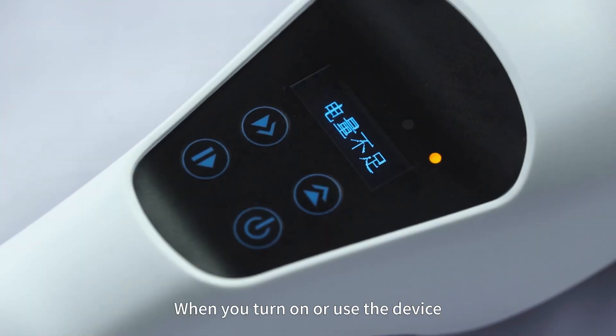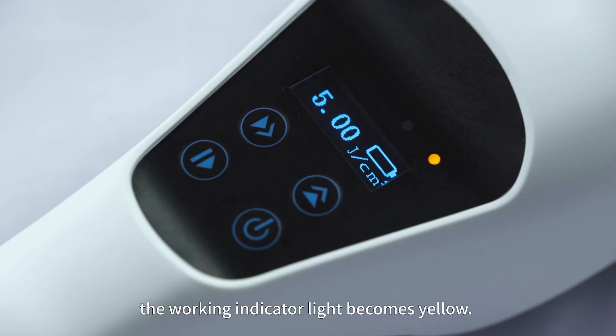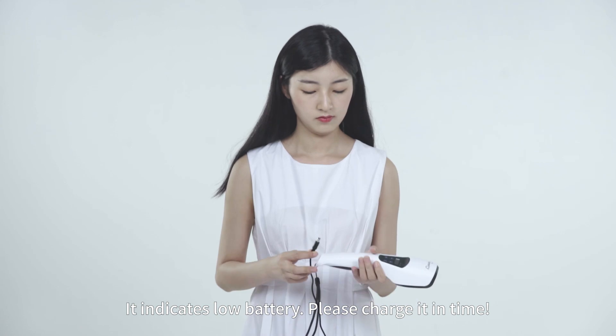When you turn on or use the device and the Working Indicator Light becomes yellow, it indicates a low battery. Please charge it in time.